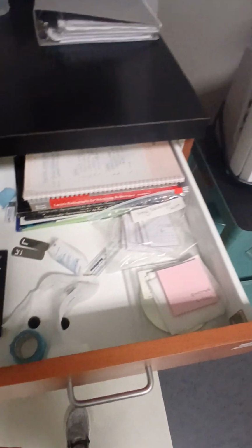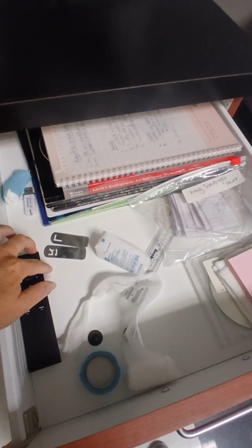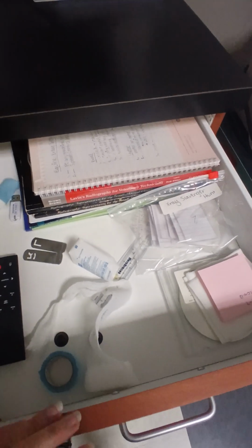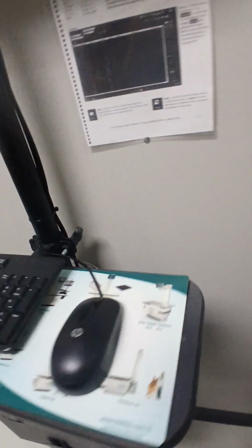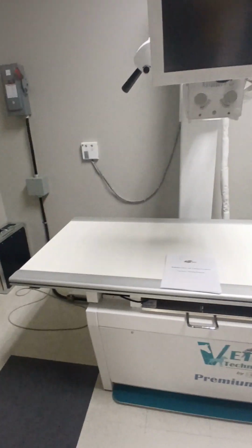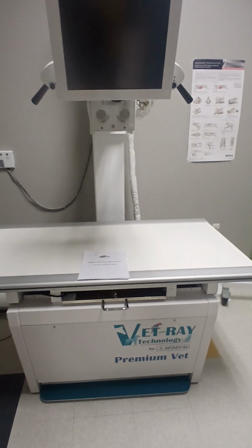Couple things inside the drawer, we have our markers to mark what side the patient is on in terms of recumbency, or if we're doing a leg study, we want to mark which leg we're doing. And then lastly, let me see if I can find our little caliper. We have a caliper that we use to measure our pet, but I'm not seeing him. He's hiding from me right now. But we'll find him and show you how to measure your pets as well. Just again, real quick tour of the x-ray room.